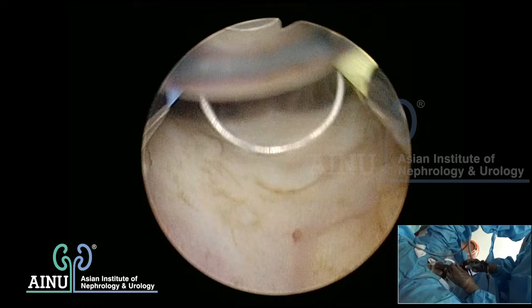Having reached my resection limit, there are two ways: either extend further leaving the lobe centrally devascularized, or if the lobe is smaller, start resecting sidewards. The first bite goes near the capsule on that side, then the second bite comes next parallelly. You start resecting the tissue from above downwards, working toward the capsule.